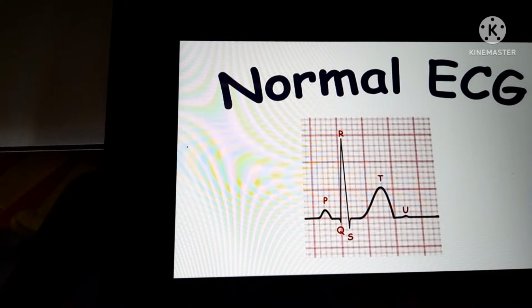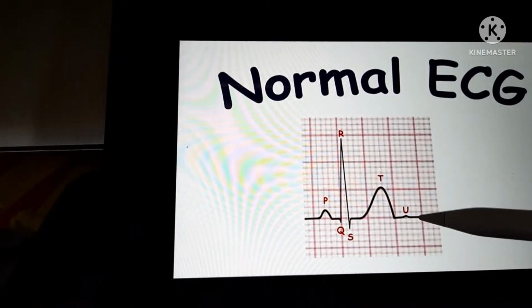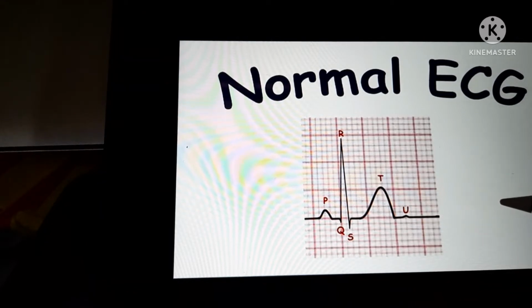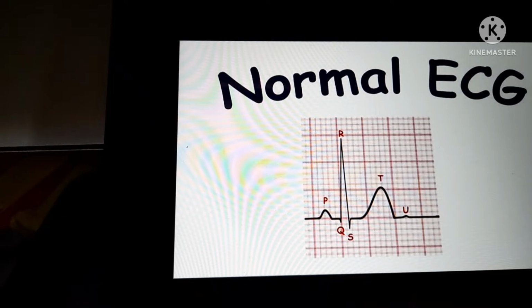I will be discussing the basics of a normal ECG. As we know, a normal ECG has a P wave, QRS complex, T wave and at times a small U wave. Before interpreting an ECG, we should be aware of a few things like its standardization, lead placements, and speed of the paper. This will help us in further elaboration of a normal ECG.